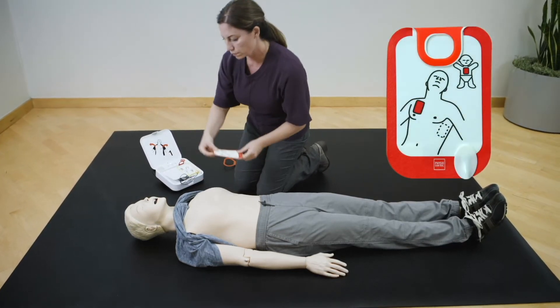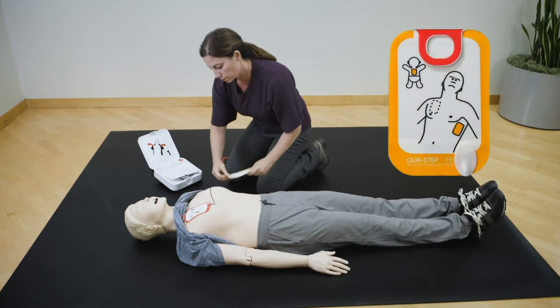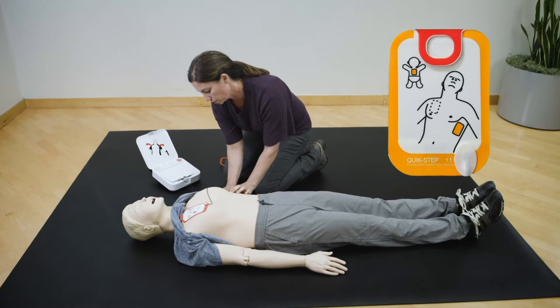Apply pads to bare skin, exactly as shown in the pictures. Press pads firmly.